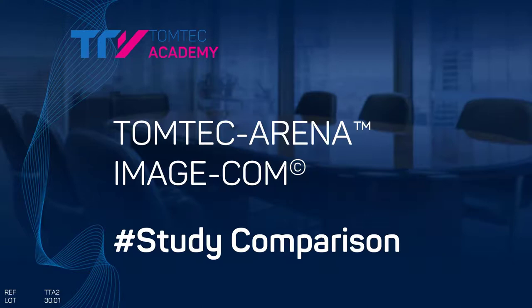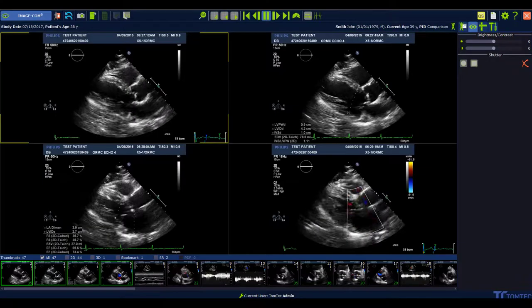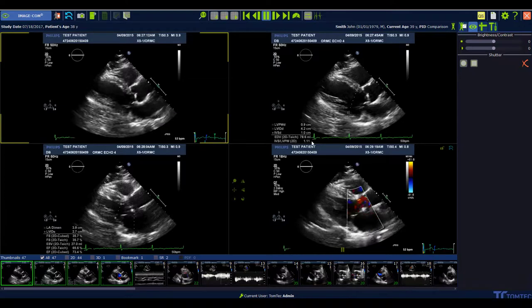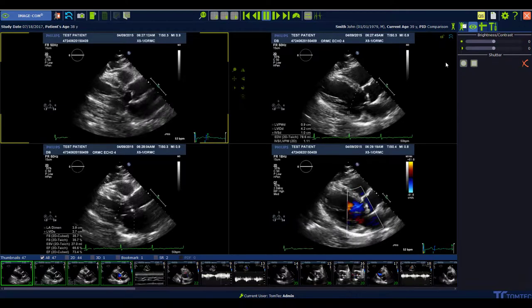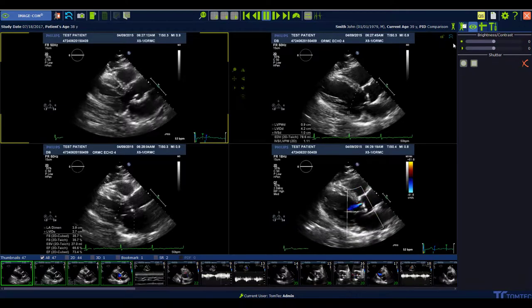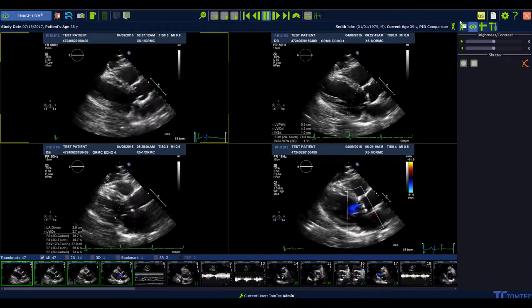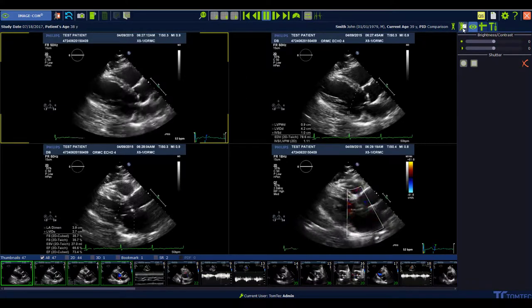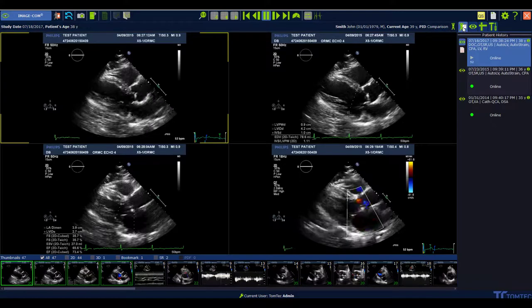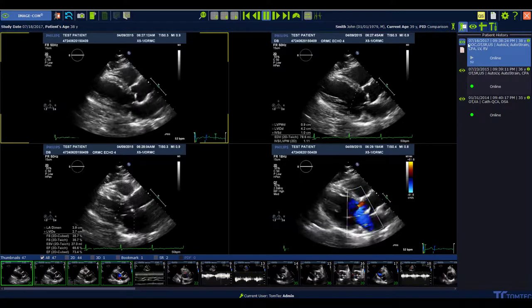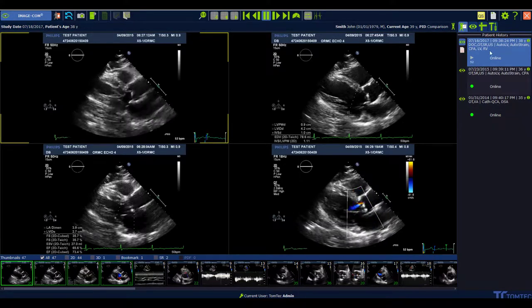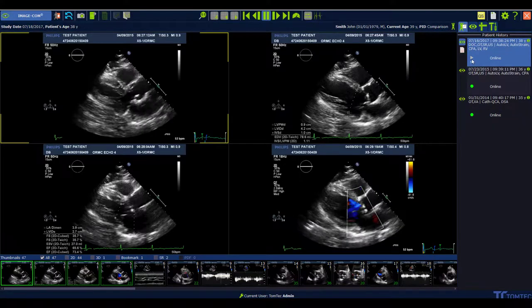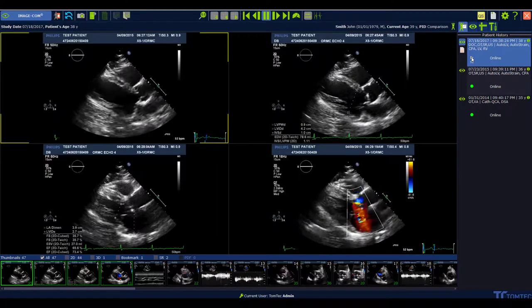How to compare studies in ImageCom. To compare studies in ImageCom, select the patient history button. Now you see all available studies from one patient. The active study is marked by the play button.